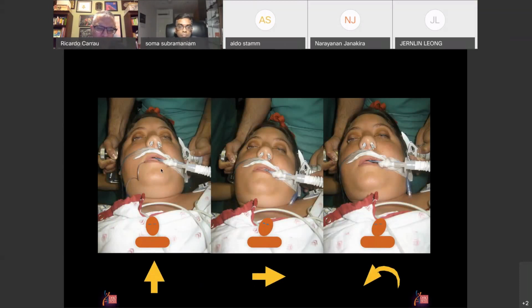So for the most part, first of all, this patient is being monitored for cranial nerves, and that's why we are putting her on pins, because the patient cannot be paralyzed. But we don't do this in the great majority of patients. The great majority of patients are really on a horseshoe head holder without pins. But what this illustrates here is the position of the head. We're going to translate that head anteriorly. That way, when you work, you don't have interference with the chest.